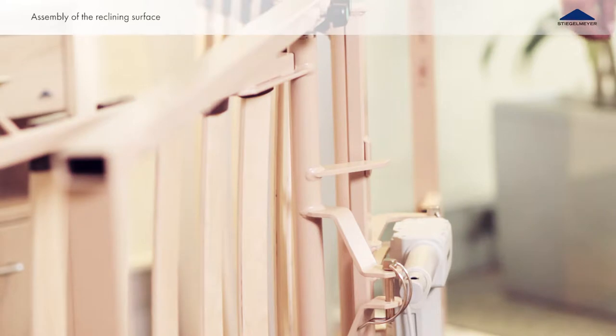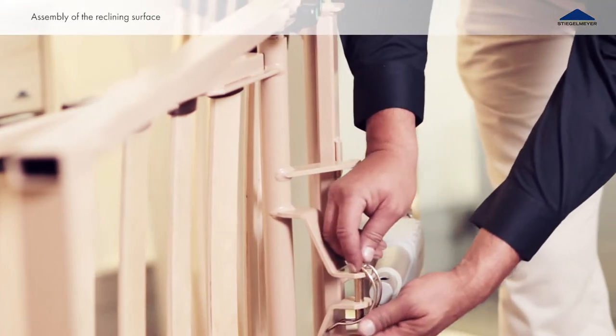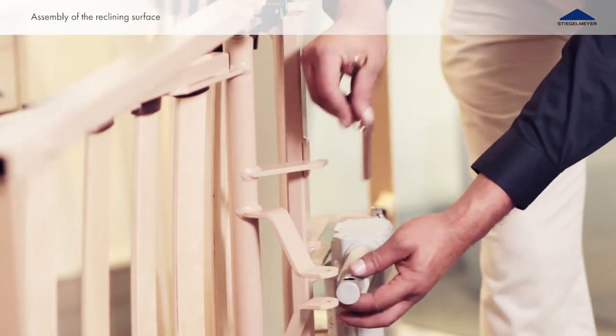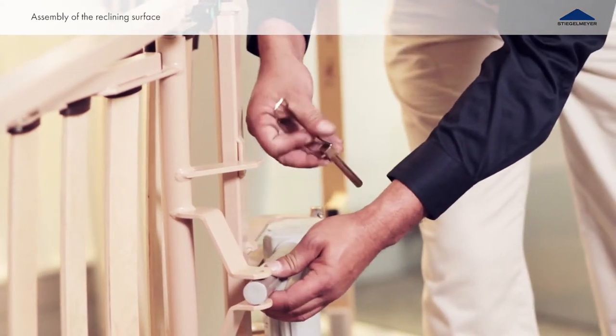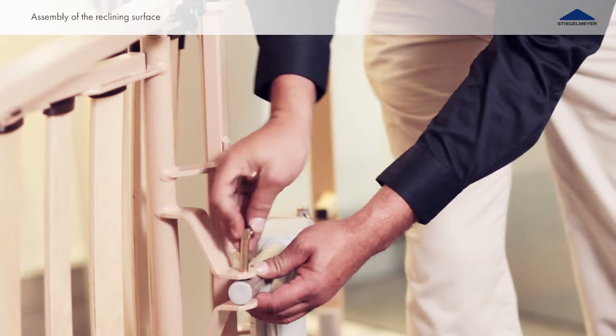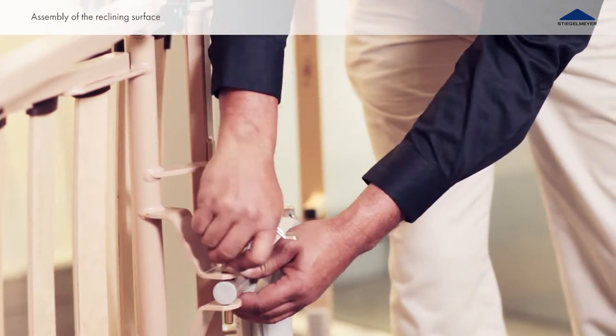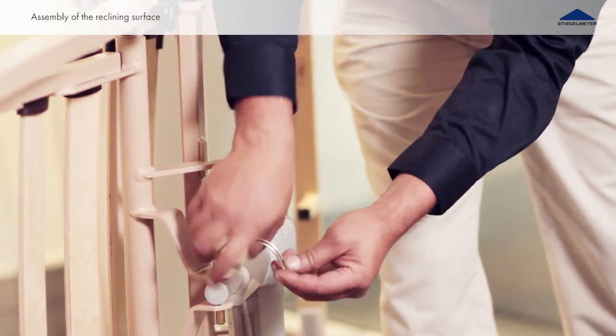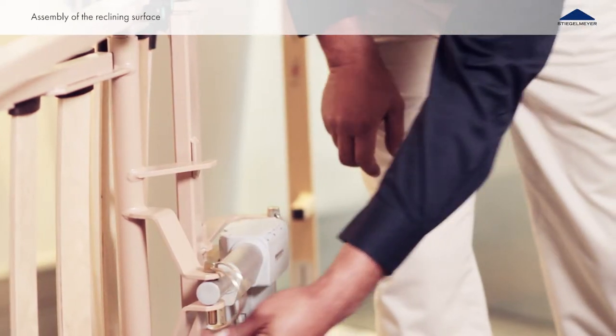Connect the lift rod of the leg rest actuator to the leg rest reclining frame. For that, insert the cotter pin through the available hole on the frame and through the lift rod. Secure it by turning over the clamping yoke for safe use of the leg rest function.